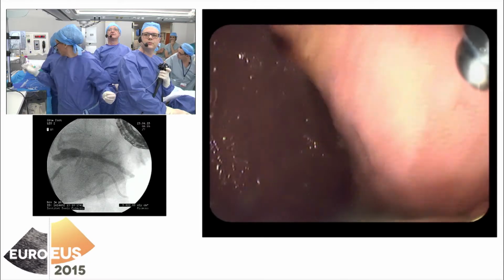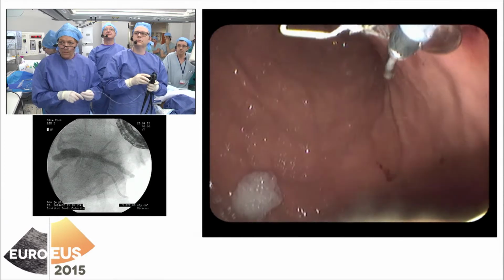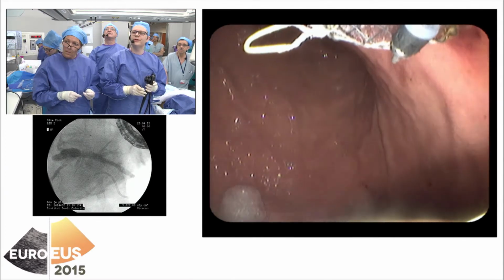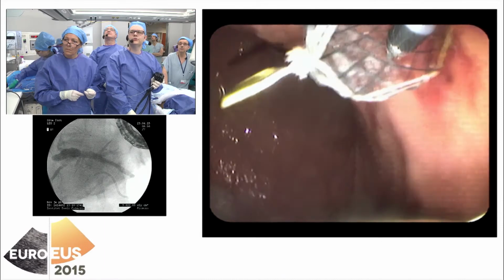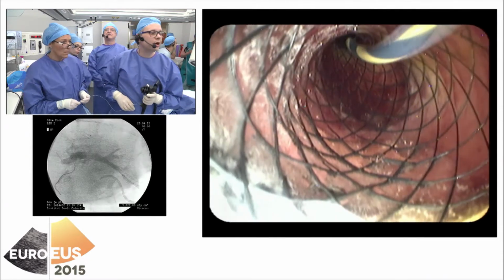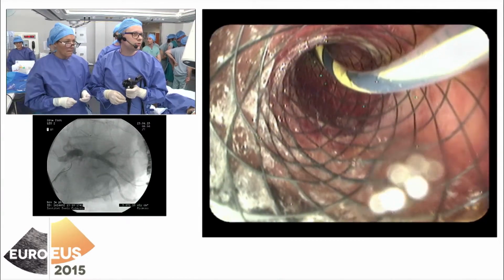Excellent. So it's not a lateral view, but an oblique view, so we are not in a good place. The idea is to push the catheter a little bit and to go vas-y, vas-y. Parfait. You are well inside for the guide wire. Okay, and there, don't push the stent too much. That's perfect. Slowly.